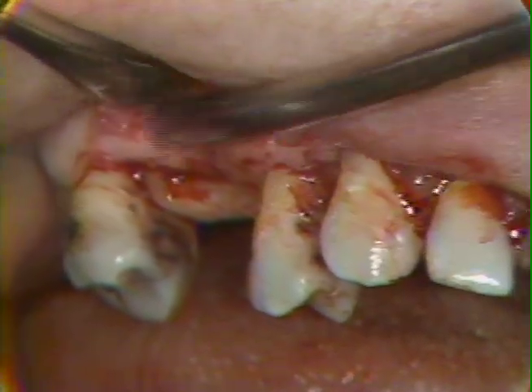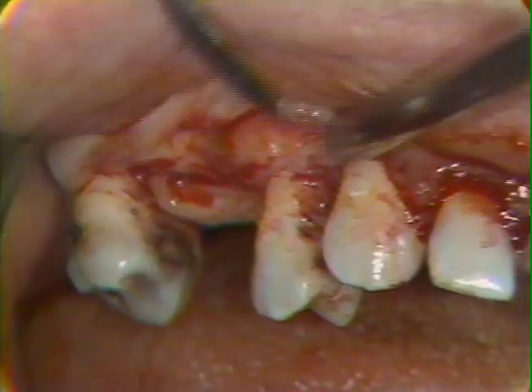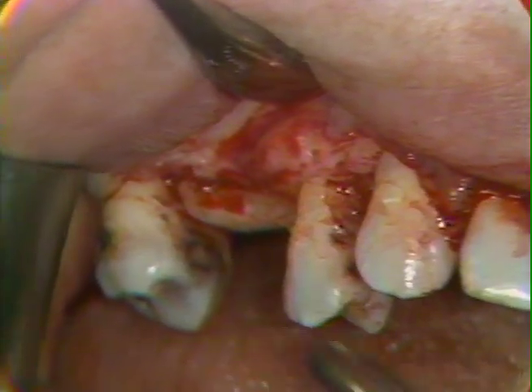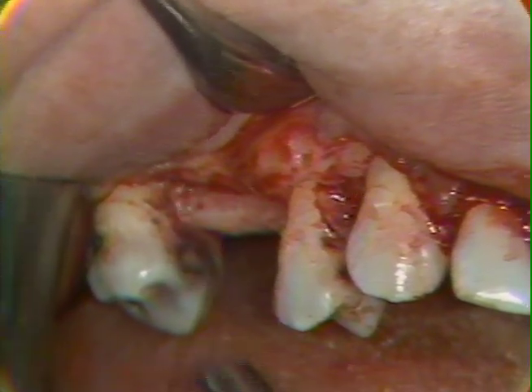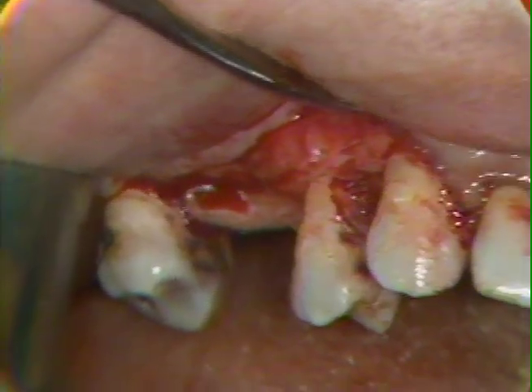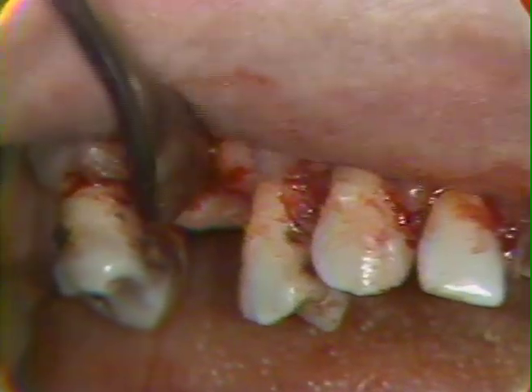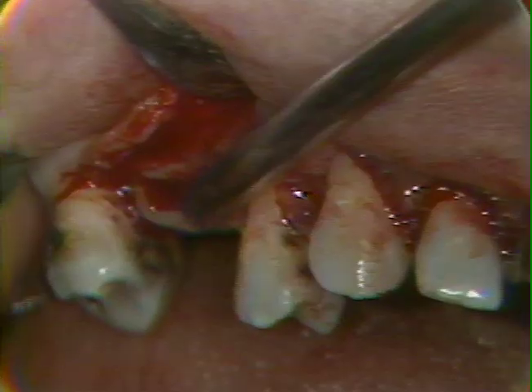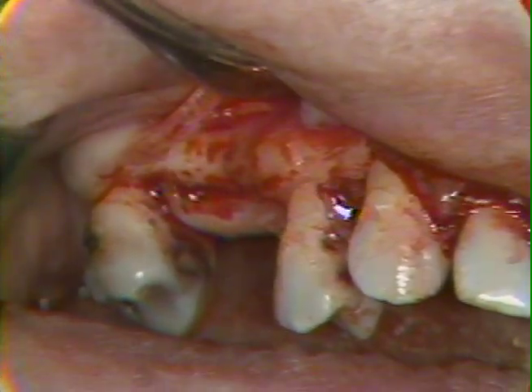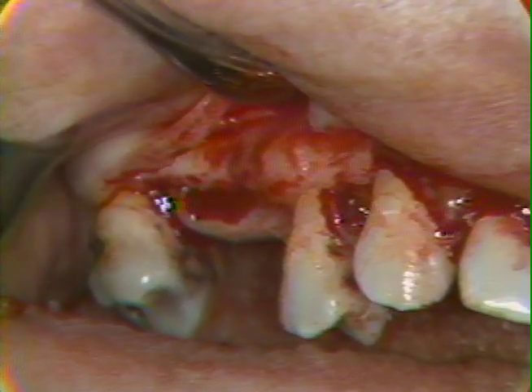Because the bone is atrophied between these 2 teeth and is very heavy around this one remaining tooth, as we take hold of that tooth with a forceps, we're very apt to crack a large quantity of bone out in the fracture of an alveolar process. We would like not to do that, and so we will remove some of this undercut by means of instrumentation. We could start with a Rongier forceps and use that to reduce some of the bone.